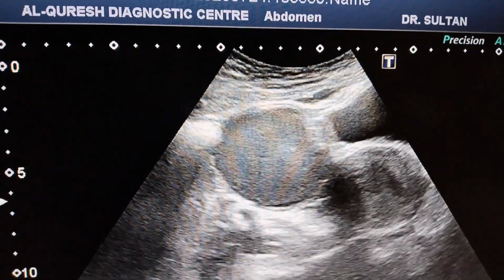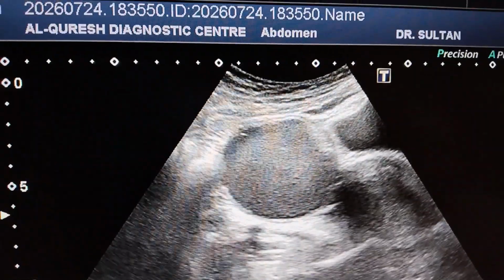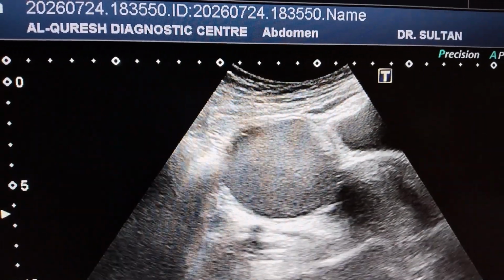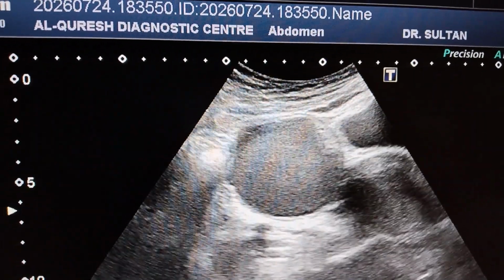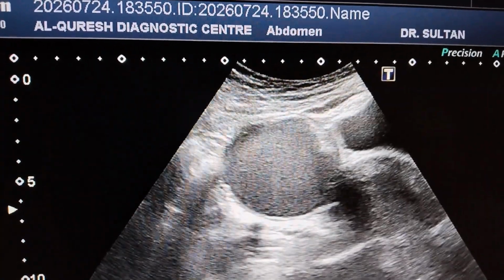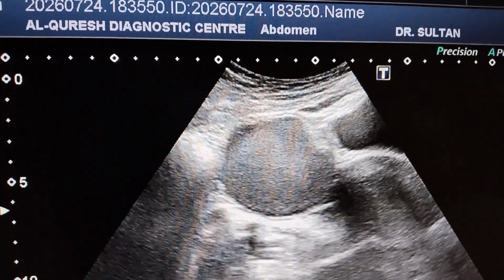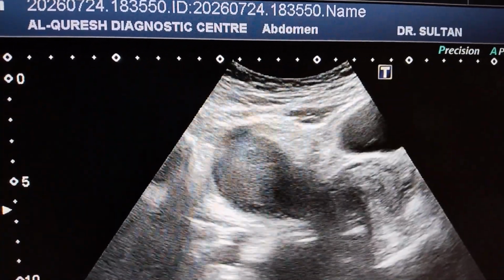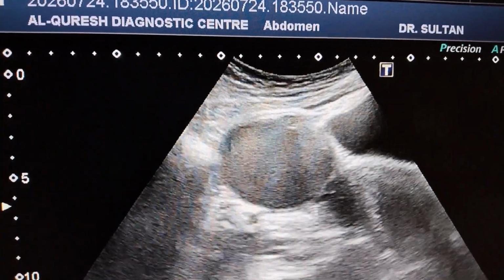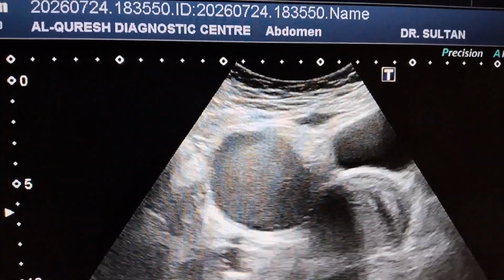Today we are going to demonstrate the endometrioma, that is also called chocolate cyst. We will discuss this lesion and its ultrasound finding step by step and one by one. So do stay with me until the end of the video.